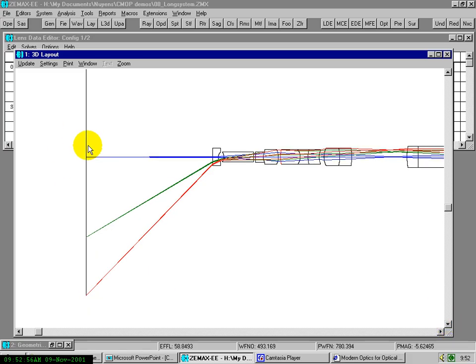You see, this is the object, and it starts with a negative group here, which makes it a very wide angle objective. And then we have a doublet, a triplet, and a doublet. And finally, we have our image here, which is an intermediate image. And basically, we are finished now, but we have to transport that image to outside.